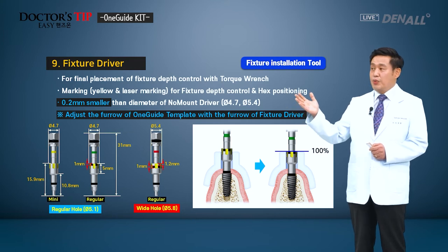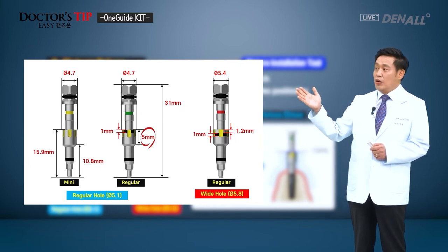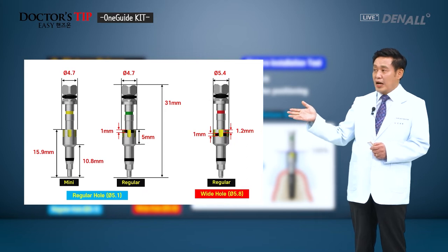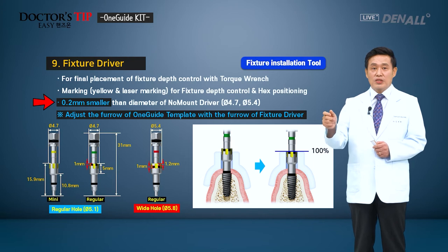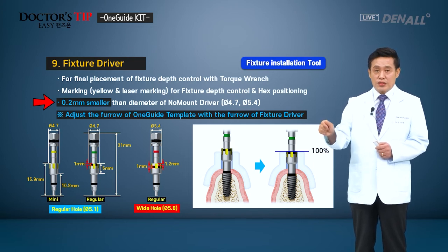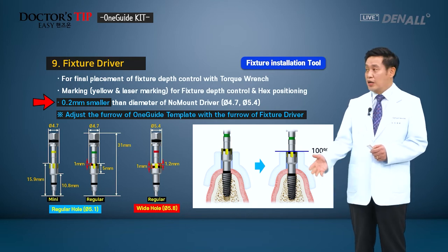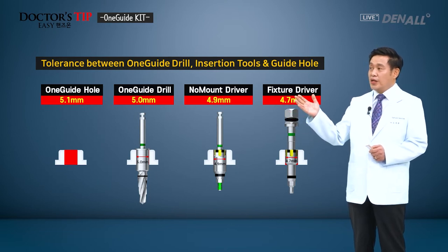As mentioned, the fixture driver, compared to the previous one, has a barrel height of 5 millimeters, so it's short, and is smaller by 0.2 millimeters compared to the no mount driver. So diameter 4.7 and 5.4 for the wide hole. For 5.8 millimeter diameter, use 5.4, and for 5.1 millimeter diameter, use 4.7. This is used because when there is jamming during implant placement, you can more easily remove the fixture driver, and there's a difference in drill sizes and barrel sizes, so you can conveniently and easily use it.